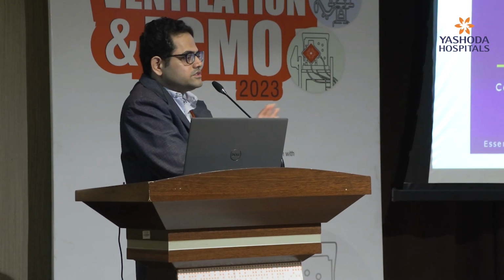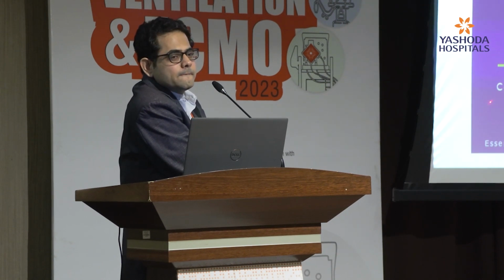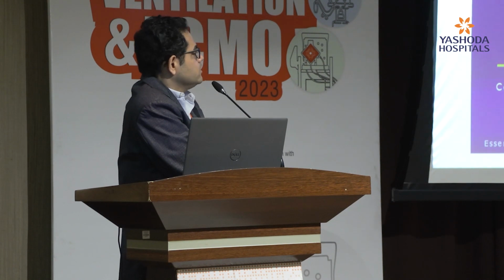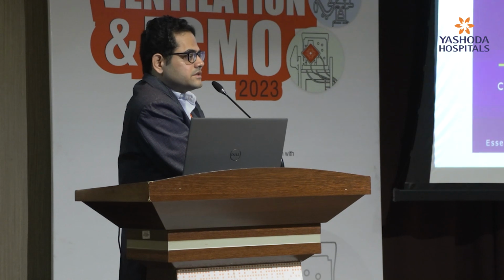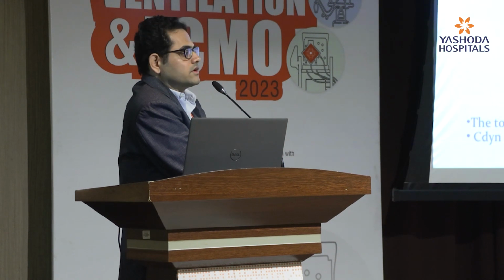So a lot of information you can get. You see here, this is a control breath. How much PEEP is attached here? If it is beginning from here, there will be no PEEP. And here a negative deflection is coming. So it is an assisted breath. The patient is triggering, the rest is controlled by the ventilator. So here again the inspiration and the expiration. This is the elastic work and this is the resistive work.